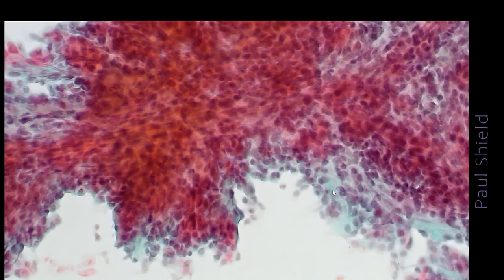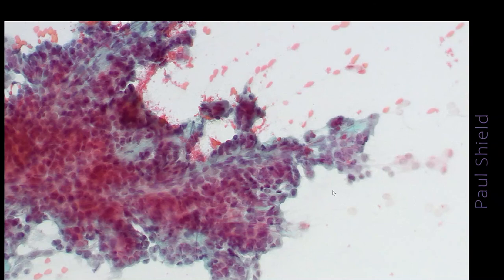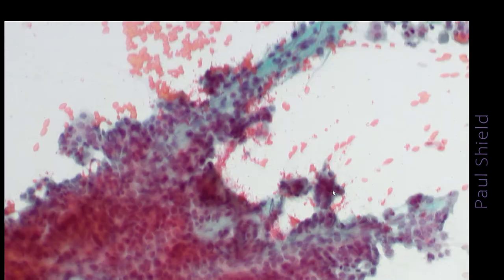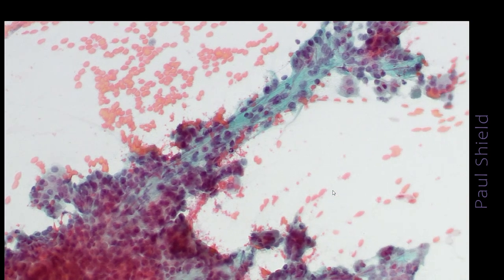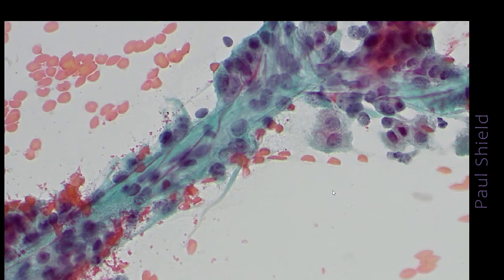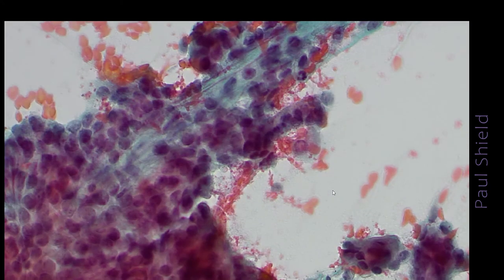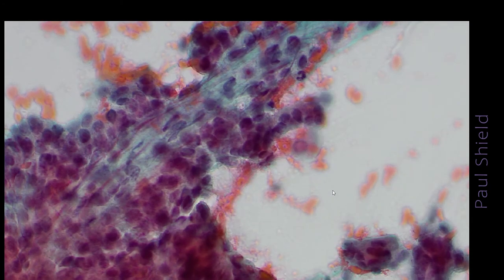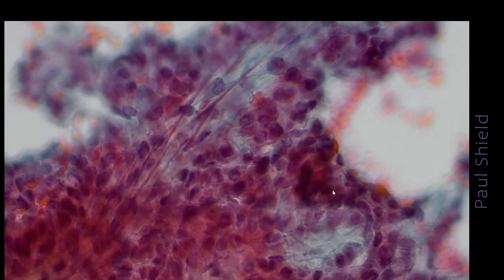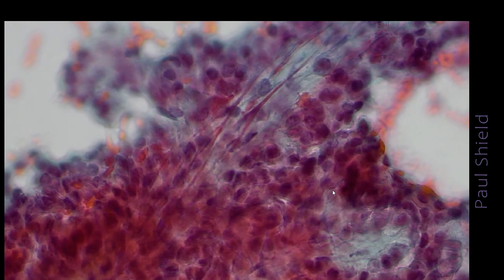Just more cores. You can see how cellular this is, just lots of sheets. There you can see some palisading of cells along the outside. And just on high power, you can see the epithelial cells arranged around the outside of that collagenous core. You can see the vessels running through there, very fine vessels. Sometimes you'll be able to make out red blood cells lying in those vessels.